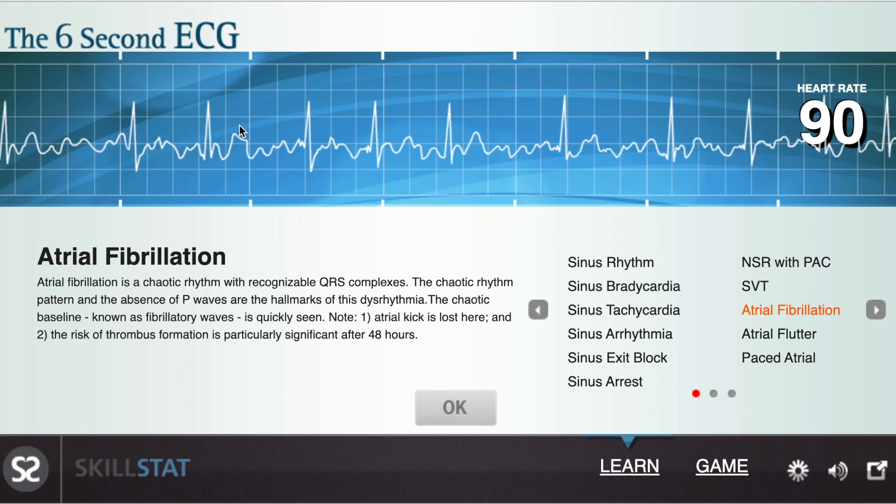Also, if you look at the distance from one R-wave to another R-wave in atrial fibrillation, they are definitely not equal throughout the strip.